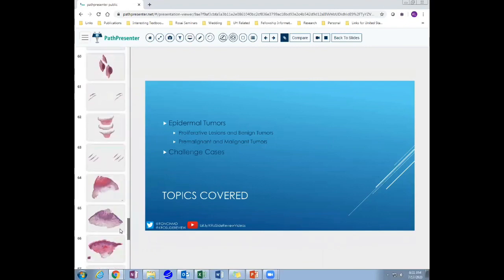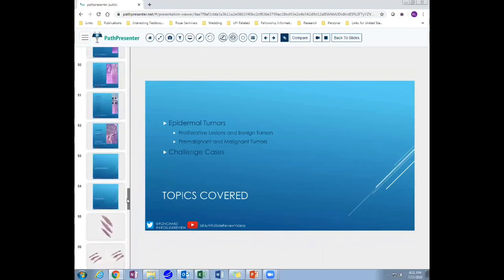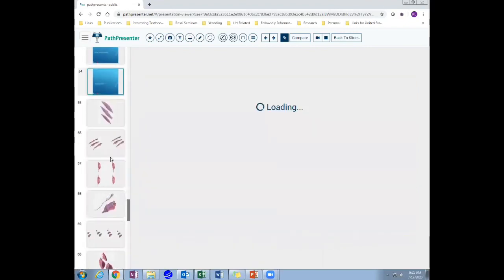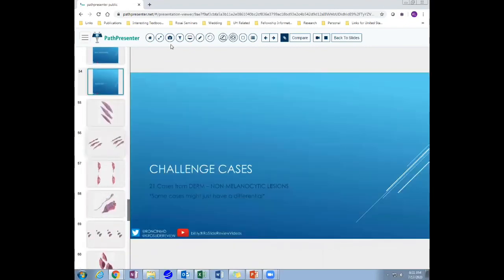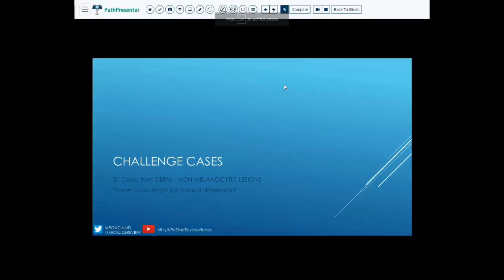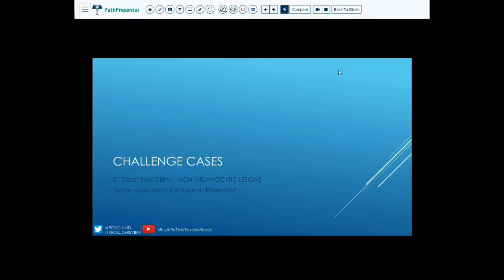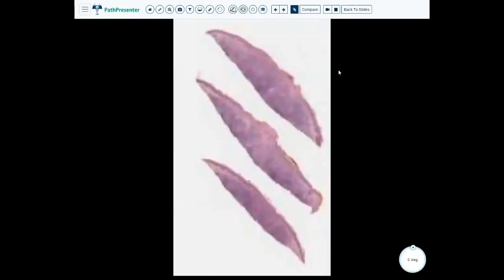There are a lot of cases today as you can see, so we're going to go very, very quickly. 21 cases. Okay, let's do this. Case one.